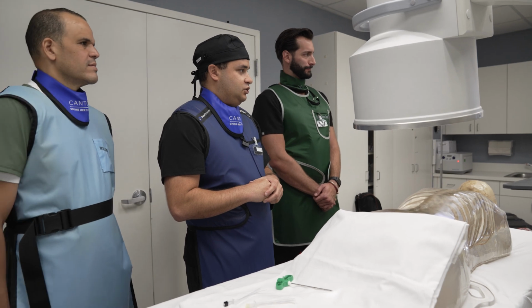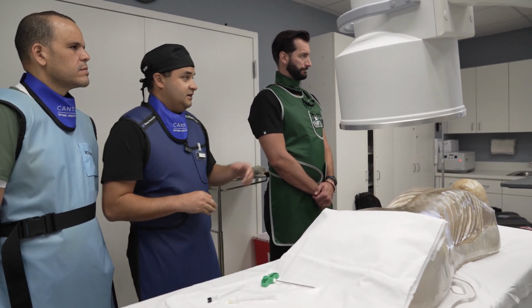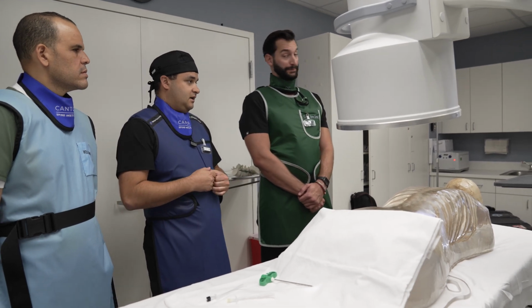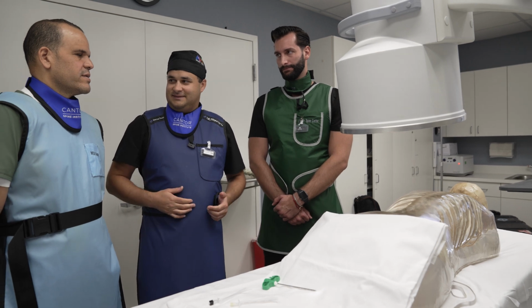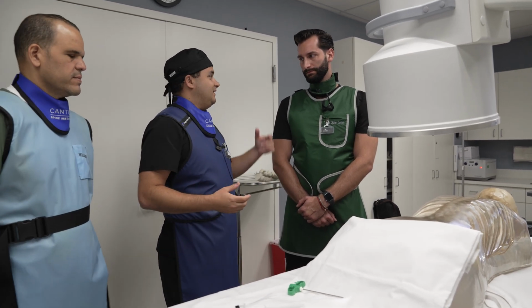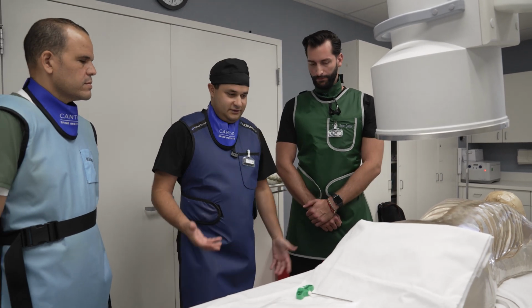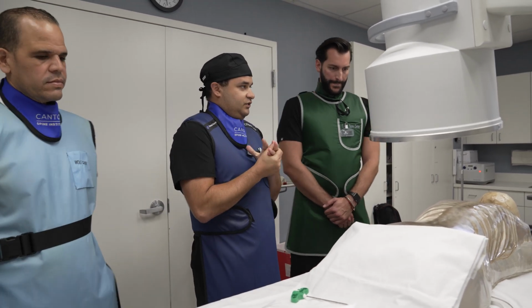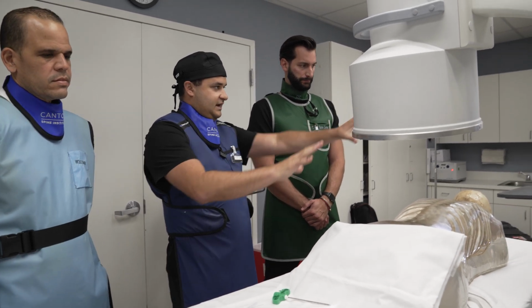Good. So why don't we go at L2-3? So we say they have an L2-3 nerve compression. And your neurology, and I'm going to put you on the spot. What nerve root's at L2-3? L2, right? So what dermatome is L2? Right there, right at the hip. Perfect. Good job, guys. So we're going to treat, we'll go on the right side since we did the left side for the last one. So we're right in AP, right?